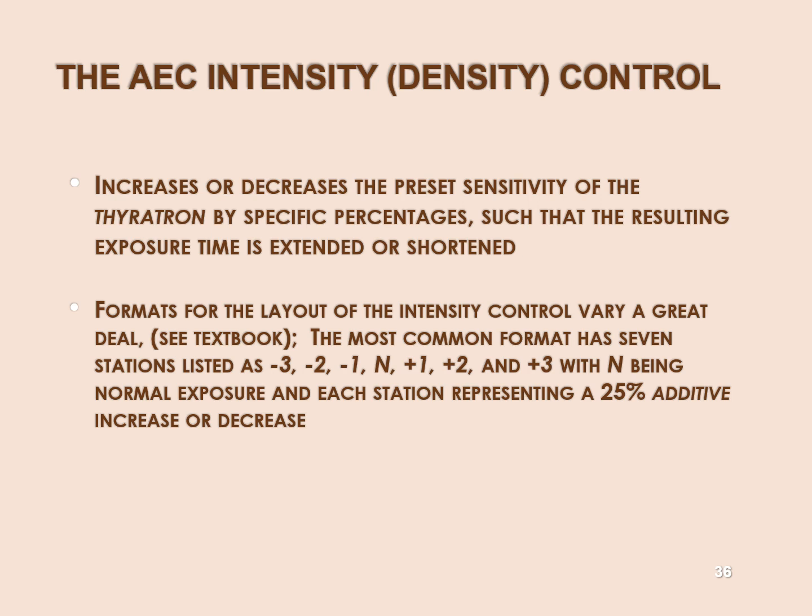So the automatic rescaling software undoes what you did with the density button. It counteracts the action of the density button. So that's why I say the density button is obsolete. Shouldn't be using the density button. The only thing you're doing, especially if you're going to +1 density or +2 density, is just increasing patient dose, because the rescaling software is trimming back the intensities of your raw signals into the expected range.